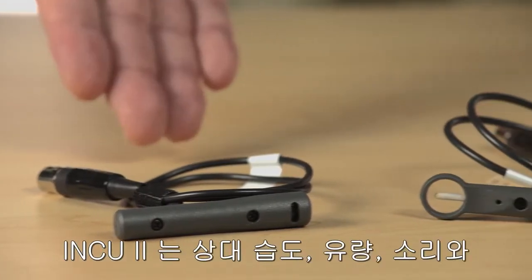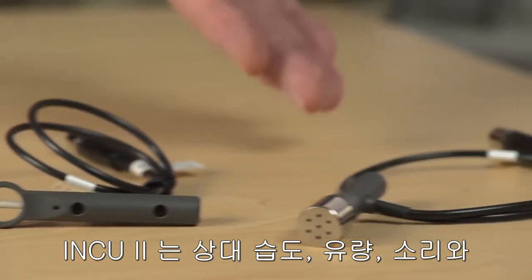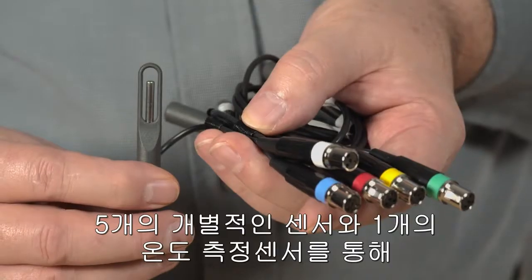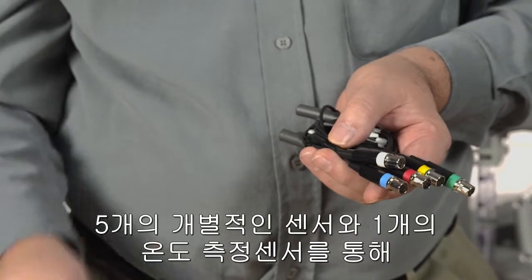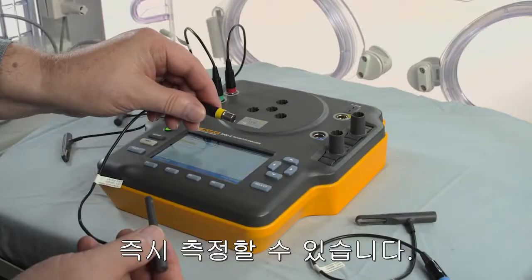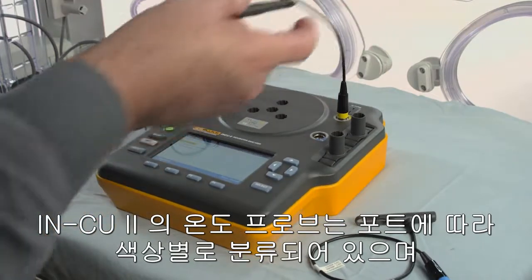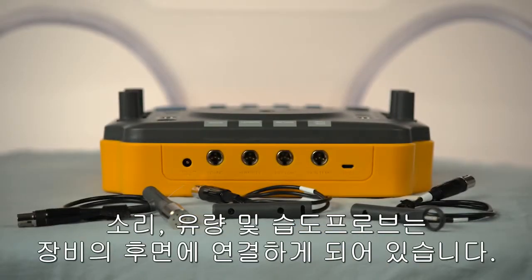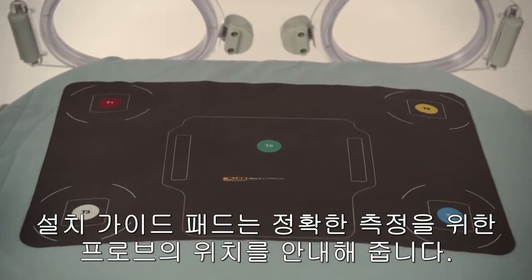The INQ-2 can simultaneously measure relative humidity, airflow, sound, and temperature at 6 points, using 5 independently movable sensors and 1 K-type thermocouple for skin temperature. The INQ-2's color-coded temperature probes match the respective ports. Sound, airflow, and humidity probes plug in the back. The placement pad helps ensure the accurate placement of the probes for more accurate measurements.